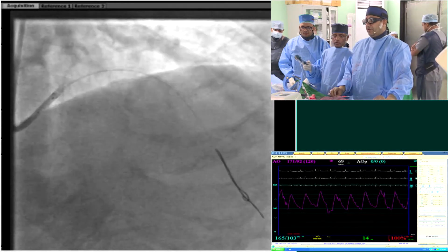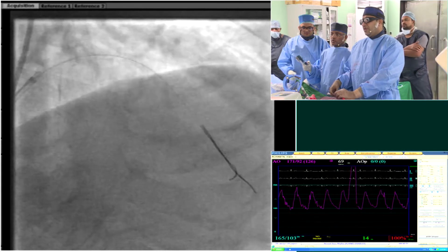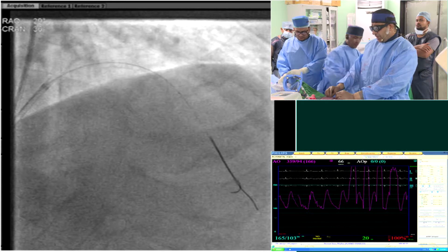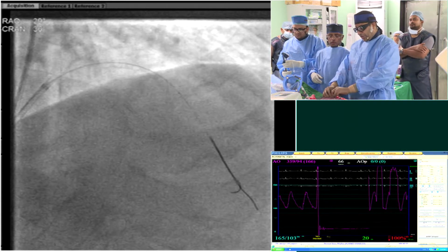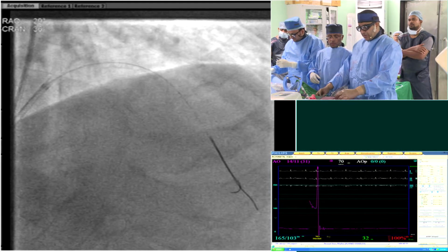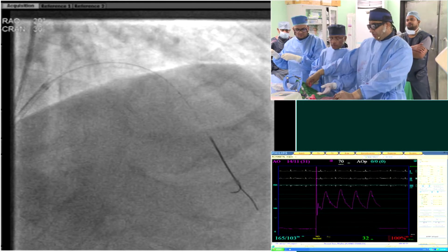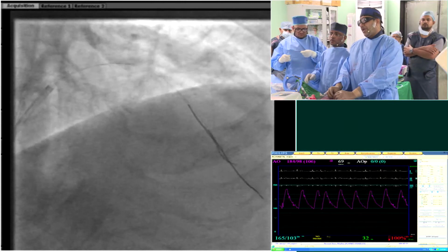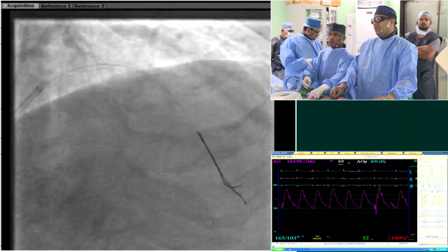I think one of the things you have to consider is if you stent the distal, what are you going to do with the proximal? What's your plan? I think I would like to rotablate it further. Leaving it alone wouldn't be a good idea. Yeah, if you're thinking of surgery, then stent the right mid segment. What stent will take? So let's take a shot first.